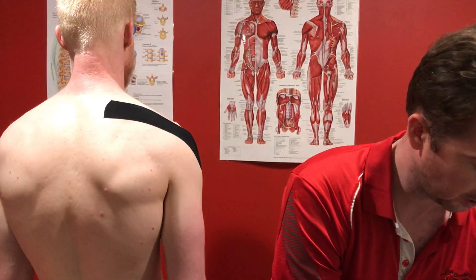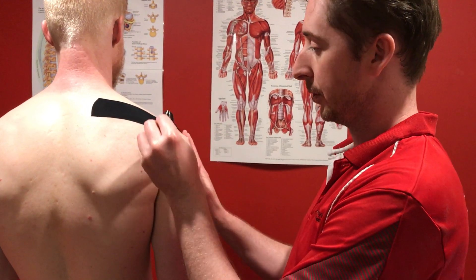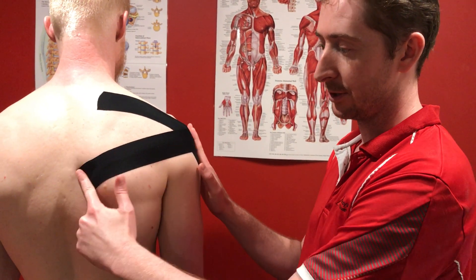Our next one is to go across, down through, across to the lower traps, across the infraspinatus line, sticking down one inch, stretch, stick.